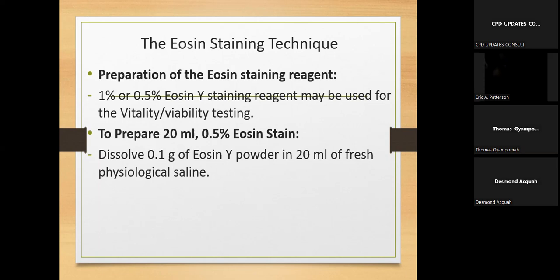Yes, divide by 5. Great. So we divide the 100 mils by 5 and we get 20. So you must also divide your 0.5 by 5.